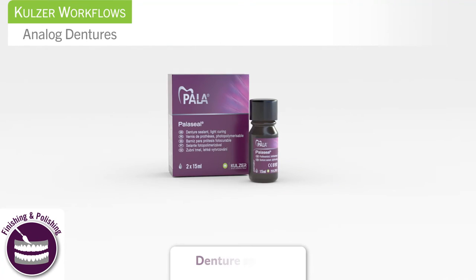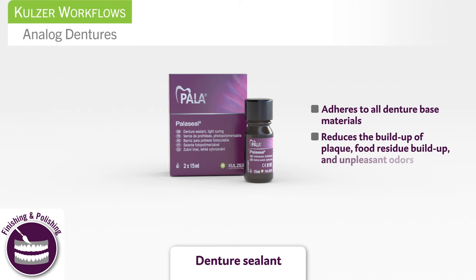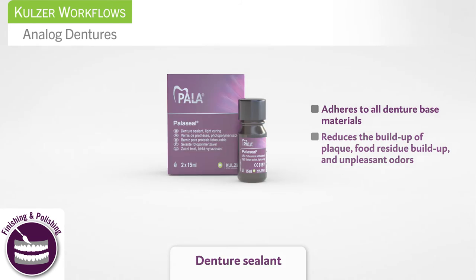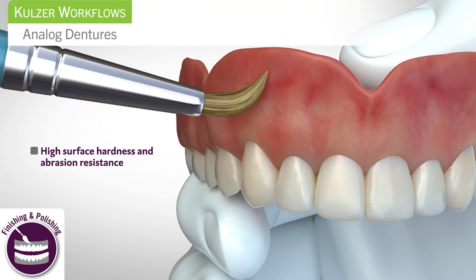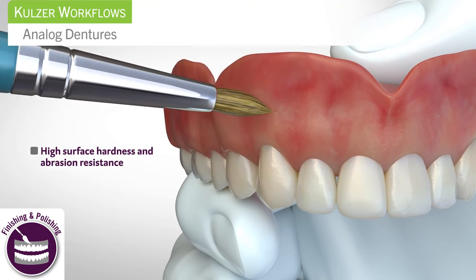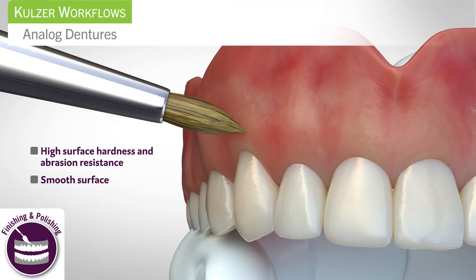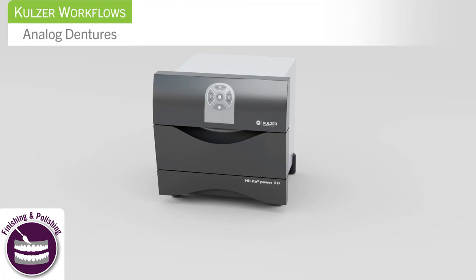Pallet Seal is a denture sealant that improves the aesthetics and durability of dentures by preventing the buildup of debris and unpleasant odors. Pallet Seal yields high surface hardness and is resistant to abrasives and denture cleaner solvents. Apply a layer of Pallet Seal before polymerization to create a functionally durable appliance.